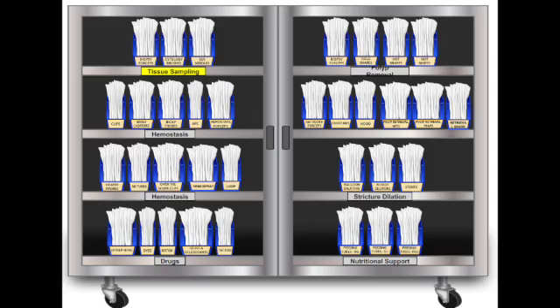Okay. Finally, stents. Metal or plastic tubes. Main use is obvious. Relieving obstruction, right? That's the primary driver, yes. Relieving malignant obstruction, cancer blocking the esophagus, stomach outlet, colon, or bile ducts, restoring passage for food or fluids. But they do more. Much more.